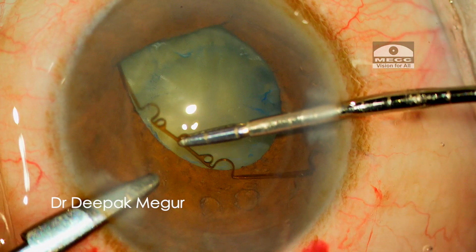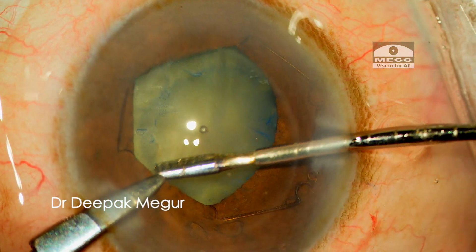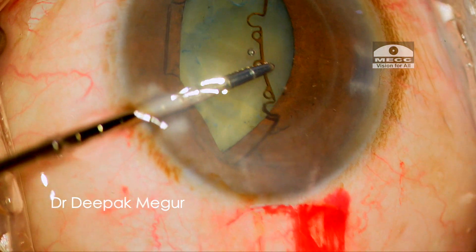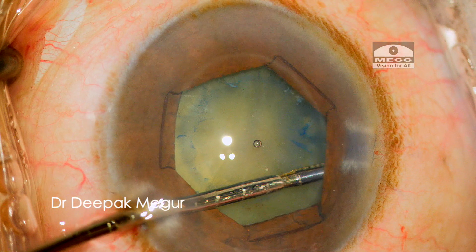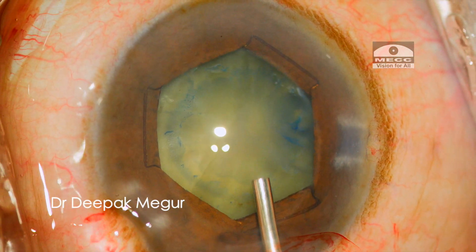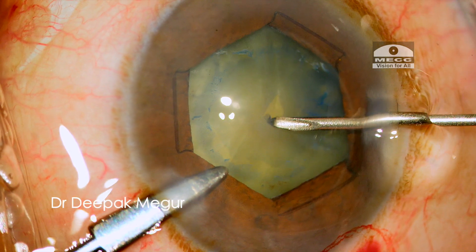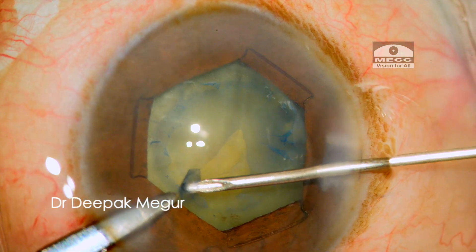The next alternative pair of notches are engaged onto the pupillary margin. Now, switching hands, the forceps is used from the opposite side port to engage the remaining pair of notches into the pupillary margin. Once the ring is placed, we have a decent amount of exposure to continue with the rest of the procedure.